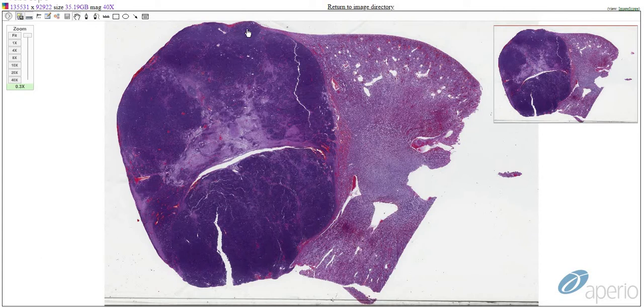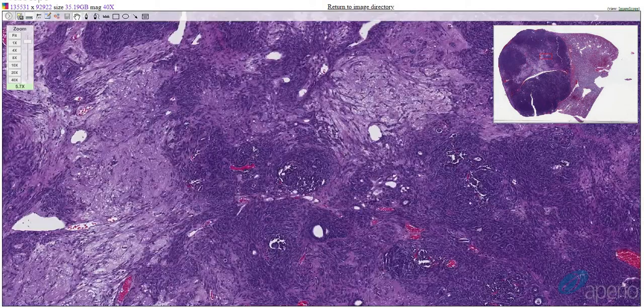Now let's look at this neoplasm under the microscope. As you can see from this low magnification, there is a large, expansile neoplasm compressing adjacent renal parenchyma. This neoplasm is well demarcated, partially encapsulated, and very densely cellular.